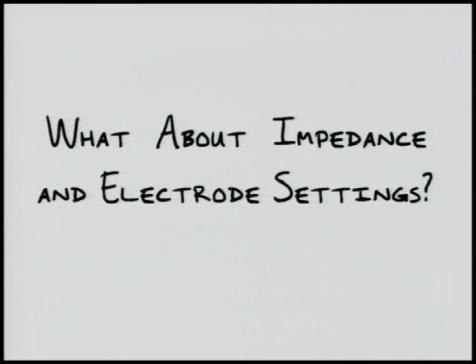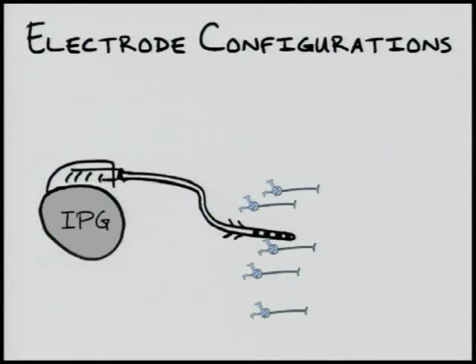Now that the basics of neurostimulation have been addressed, it's time to cover a few advanced concepts and apply the basics to troubleshooting and understanding device function. Neurostimulators work by pumping charges out of one electrode and collecting them through another. Without the two electrodes, electrical current would not be able to flow, as no complete circuit would exist.